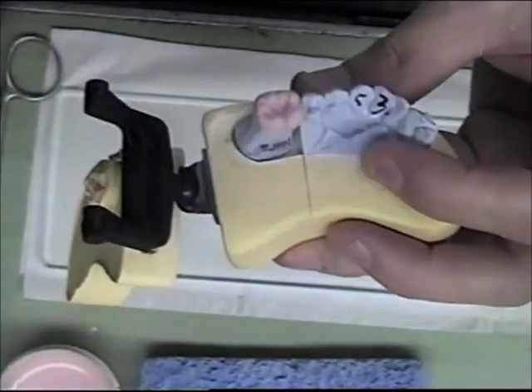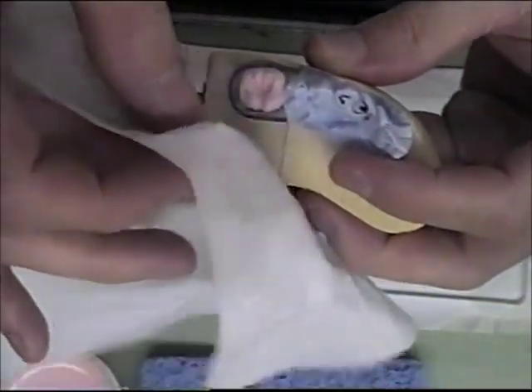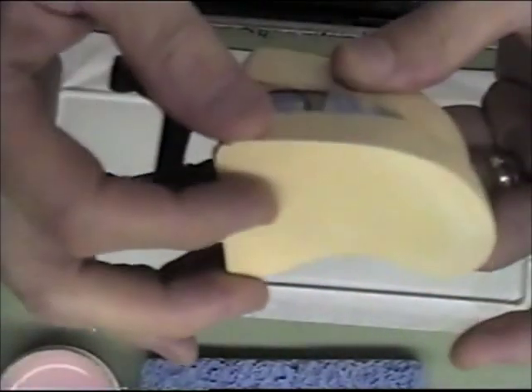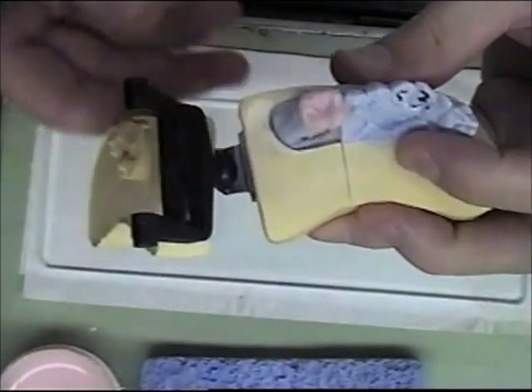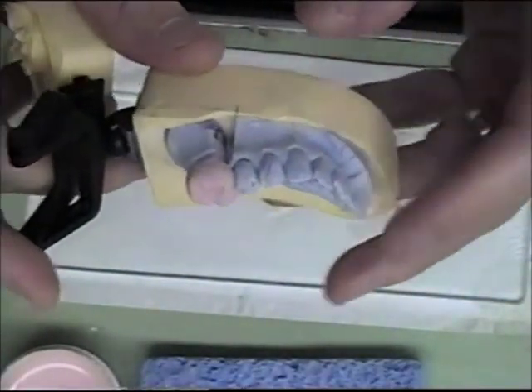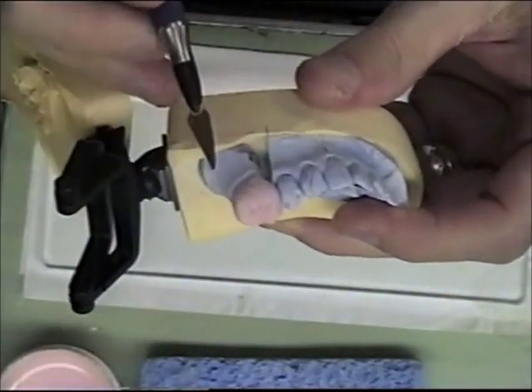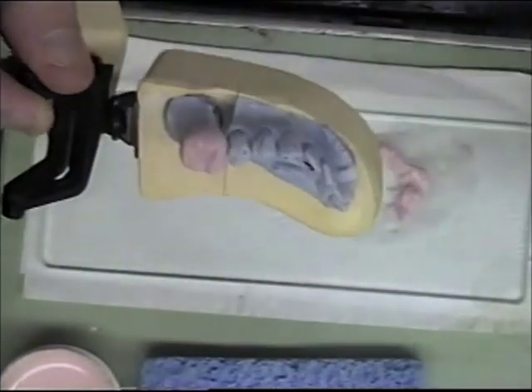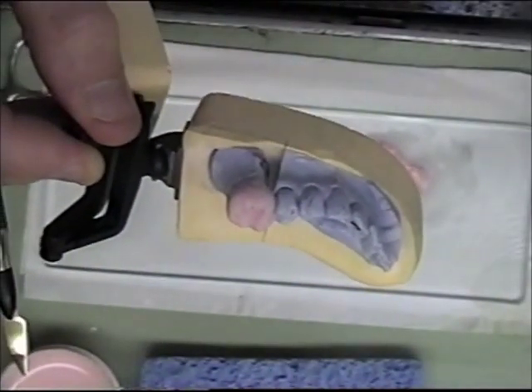The crown is now built up to its full contour. At this stage, I will cut back the incisal area to apply my incisal porcelain.